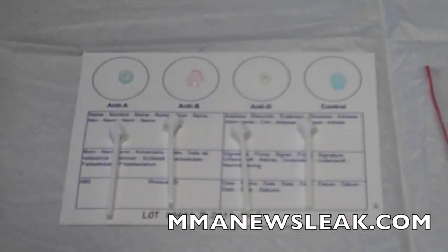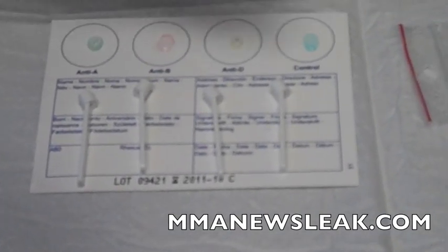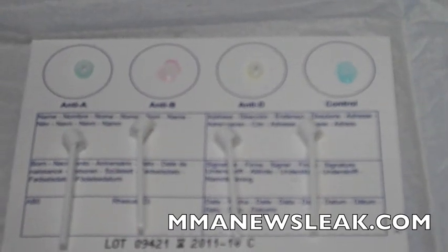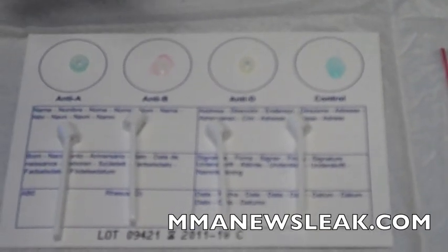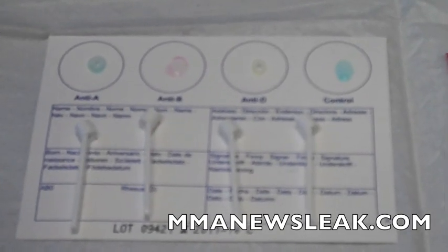The card right now has a protein on each one of these circles that represents anti-A, anti-B, anti-D, and a control. The anti-D determines if you are positive or negative of whatever blood type you are. The anti-A, anti-B, and the control help us know if you're O, AB, A, or B.